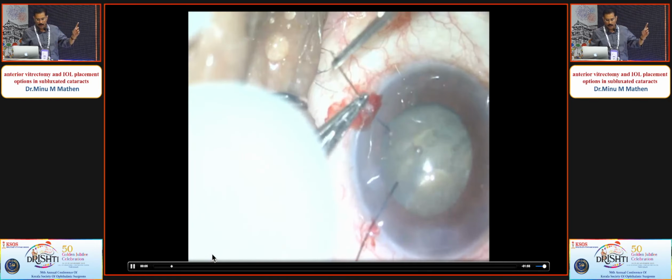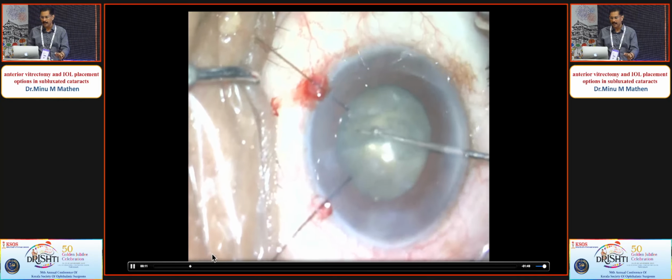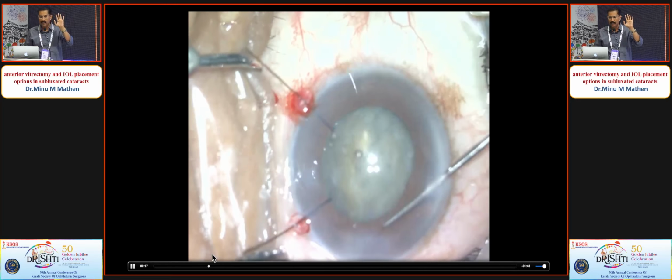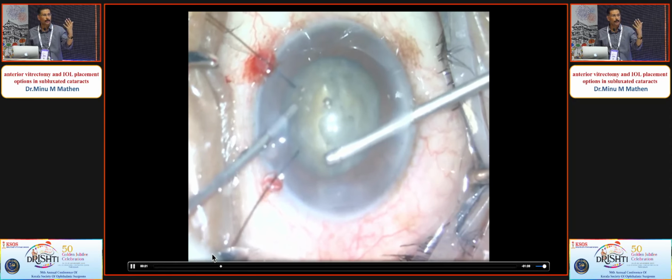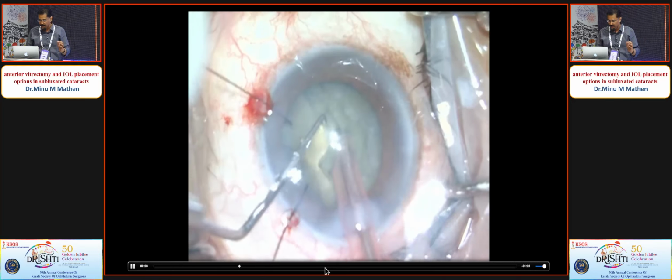So now during the surgery we could see movement there, and there was vitreous. So here again I stress, please do vitrectomy, but do only enough vitrectomy to clear the vitreous off from the anterior chamber and plug that area with dispersive viscoelastic. Because the more you do, the more the lens will flutter and move backwards when you get in your phaco probe. So once that is done, I don't want to show the phaco part of it because it was shown.